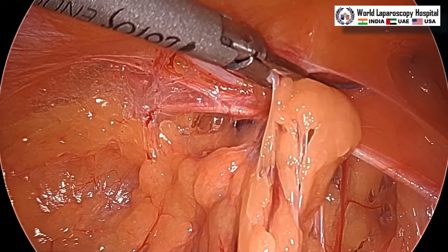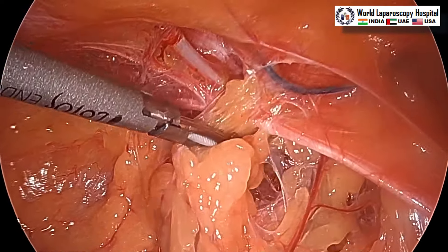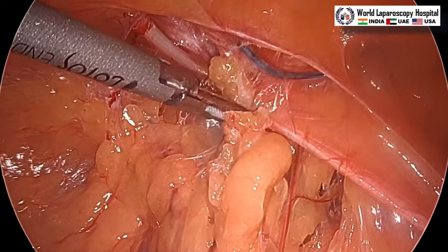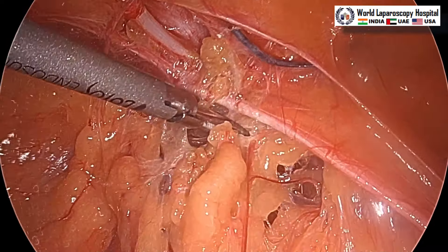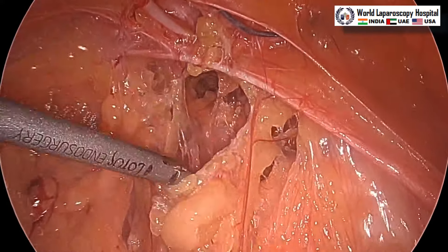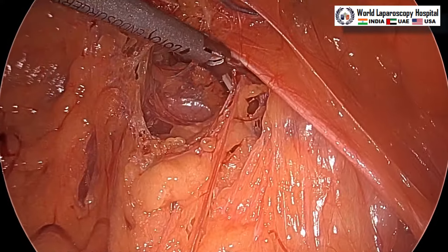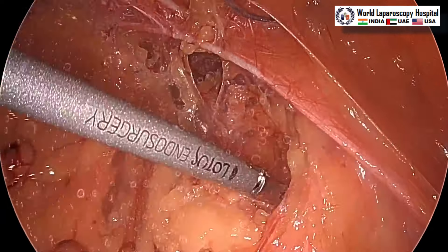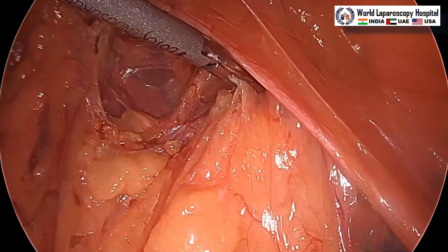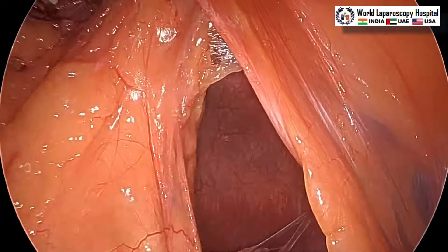Now inside we can see there is a lot of adhesion with the omentum as well as with the bowel. These are omentum right now. We are performing surgery with only two ports — one port at Palmer's/Misra's point and another at the lumbar area — and we are doing harmonic adhesiolysis. Most of the time with ventral hernia you can perform with only two ports if you have a harmonic scalpel, because gravity will act as an aid and as you keep on separating the adhesions, they will keep dropping down.